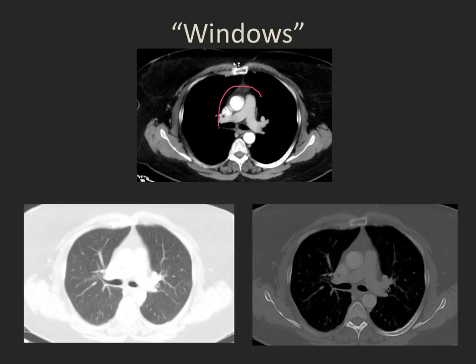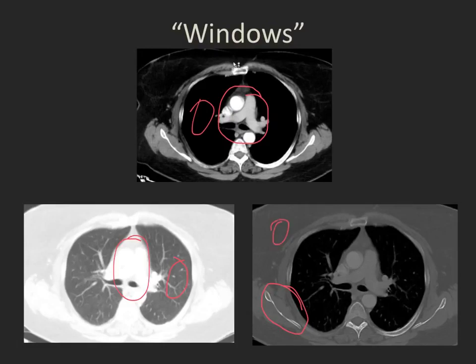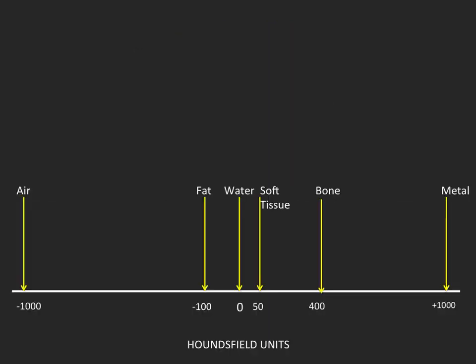For example, here we are looking at soft tissues of the mediastinum, but we cannot see the lung. We can see the lung on the lung window, but we can't see the mediastinum. And we can see the bones here, but we really don't see the soft tissues or the lung very well. This is because of the wide range of densities of the soft tissues which are found on the average CT scan.